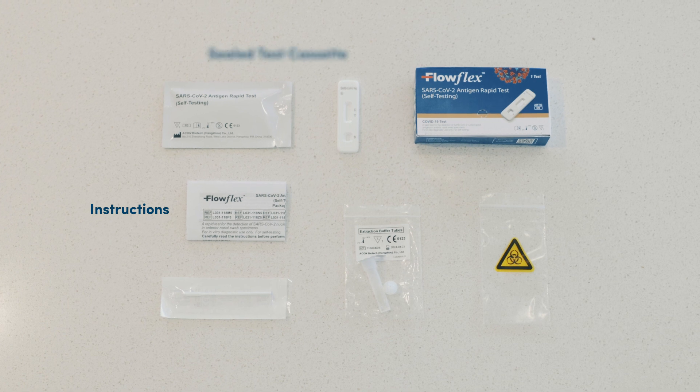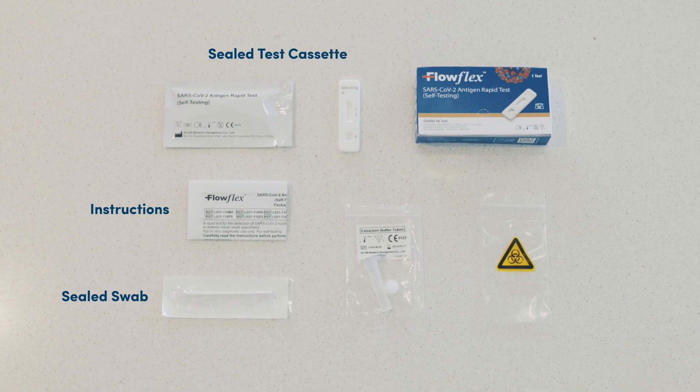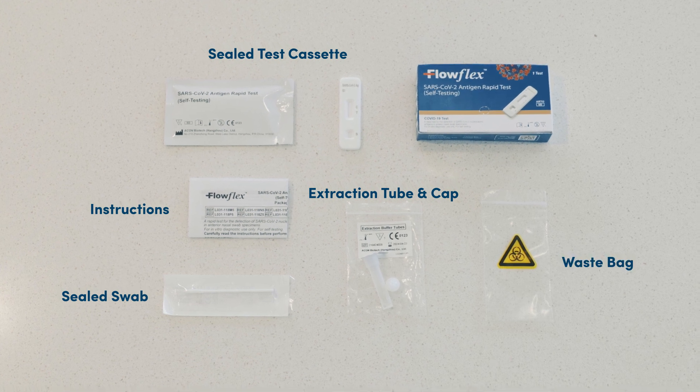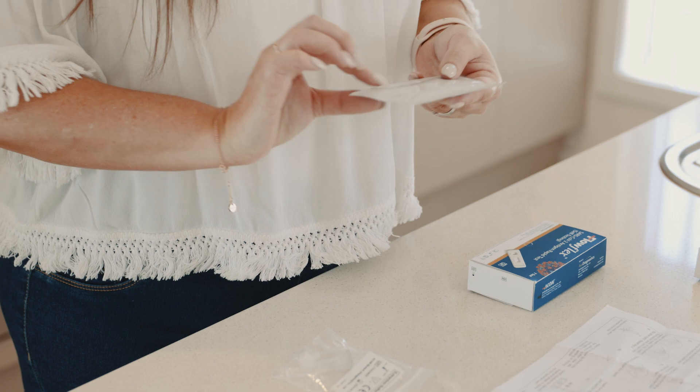Check that you have: instructions, a sealed test cassette, a sealed swab, an extraction tube and cap, and a waste bag. Check that the test cassette is sealed and not expired.